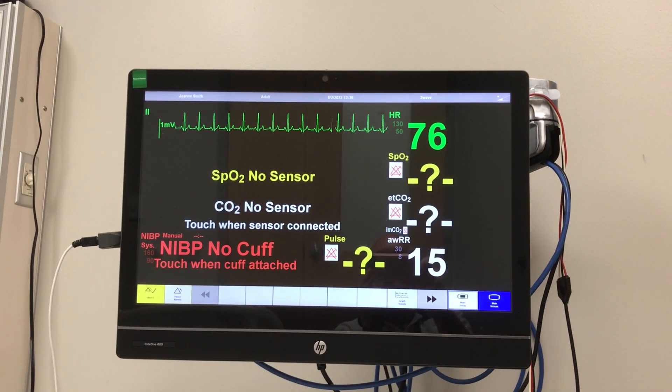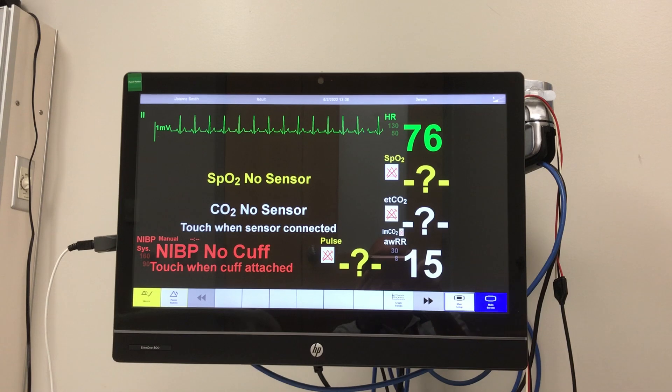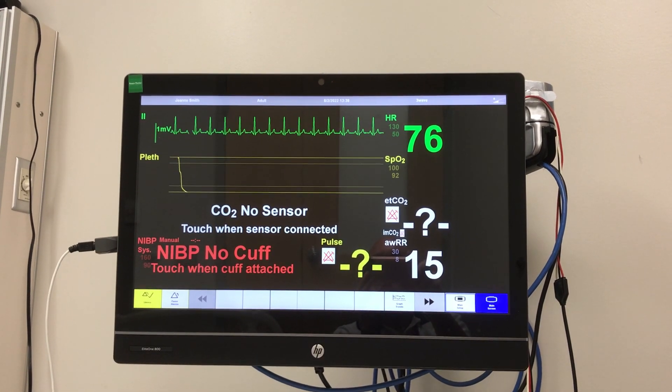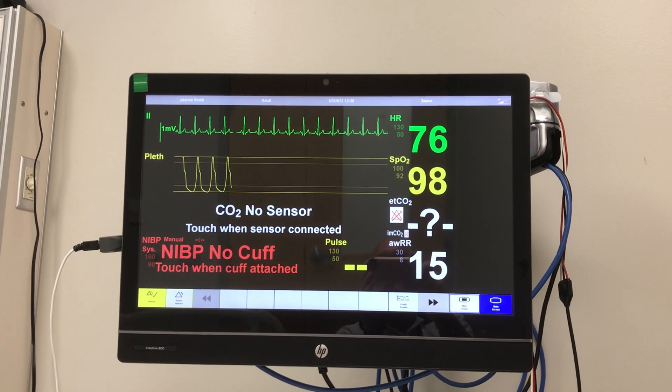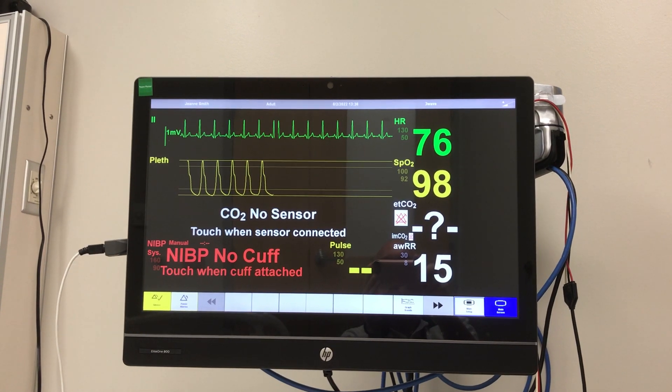For SpO2, you grab the SpO2 sensor, attach it to the patient, and you automatically get a SpO2 reading.